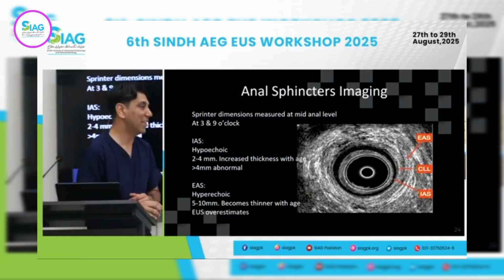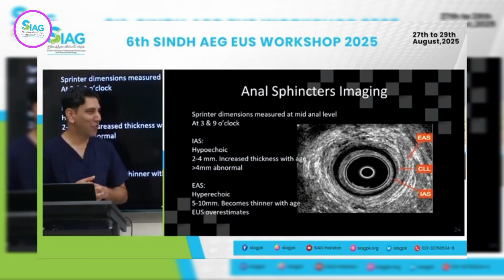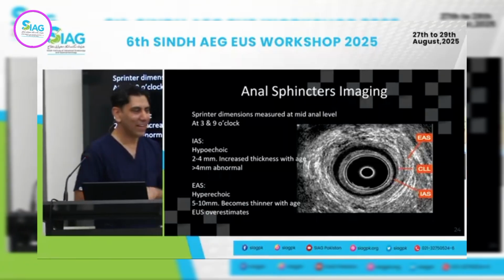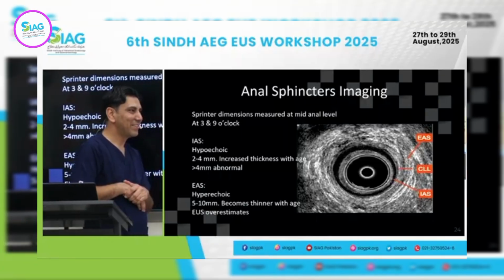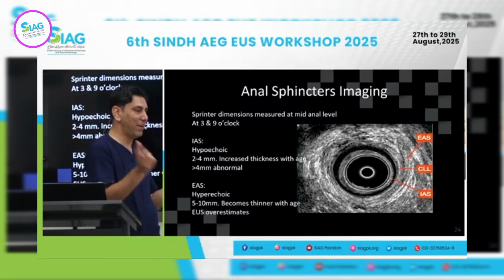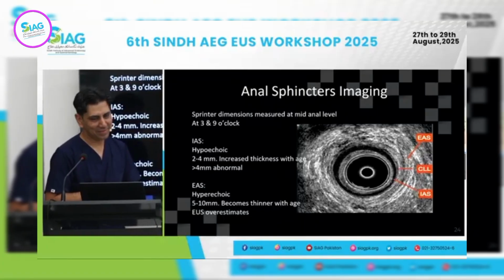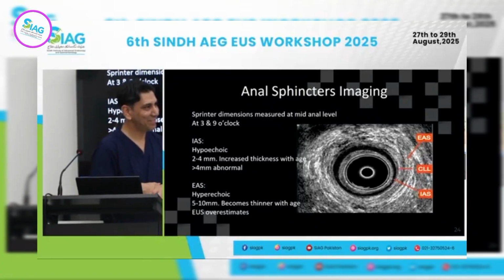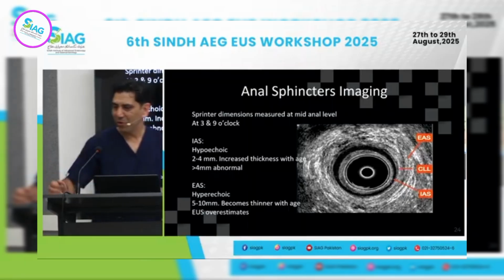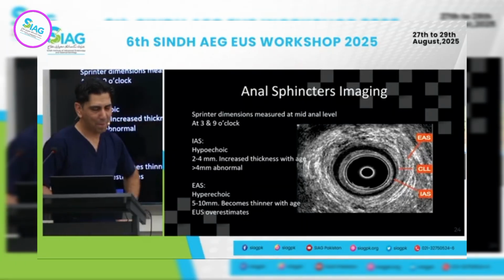Hyperechogenic. Don't know. I think it's probably because of the perirectal fat around it. Don't know the answer. Khalvi asked why the external sphincter is hyper. I think it's probably because there's a lot of reflection because of the fat around it. I don't know, but I mean that's. Happy for you to look it up, Shanil, and if you can answer the question at the end.